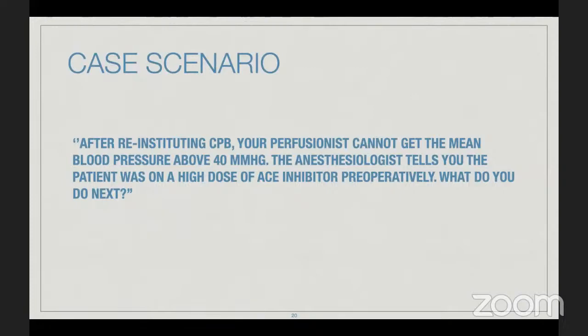Okay. You see the air normally if your purse strings are not perfect in the SVC, in the IVC, in the venous, you will see that air comes in. This is where you see it all the time in the venous system, and they can deal with it. They can deal with a certain amount of air, but a significant amount and sucking too much using the vac does cause problems. And if they have too much air, then that might be transferred to you in the arterial cannula afterwards. Yeah. Keep going if there are no more comments.